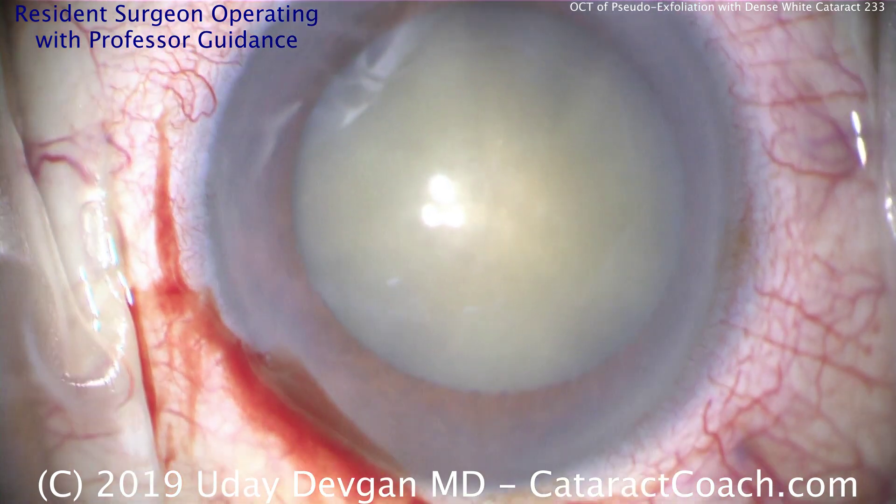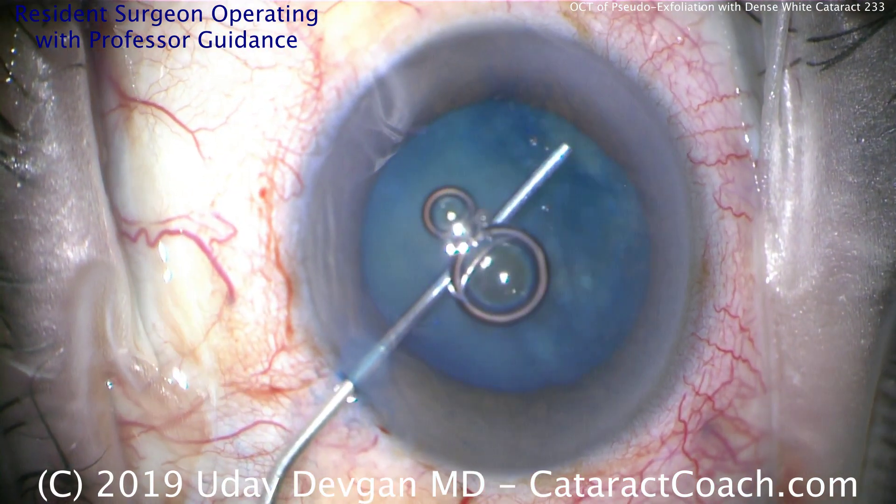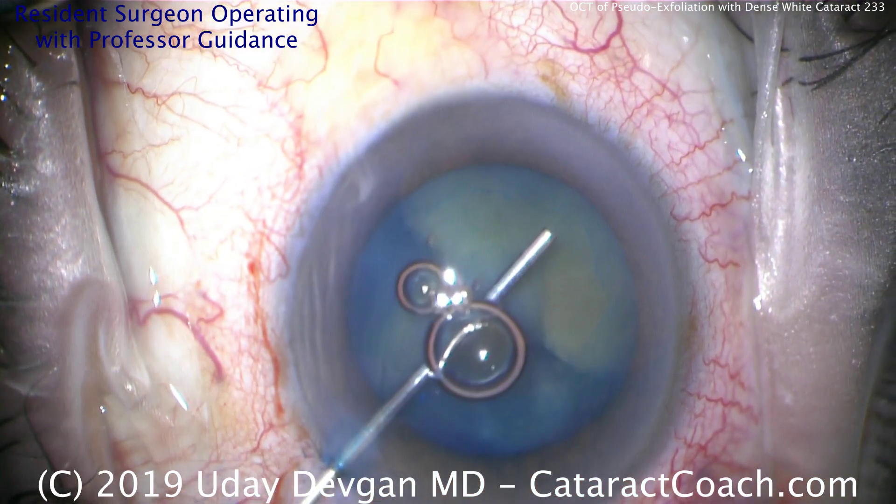Today the case is going to be a resident surgeon who's operating, and he'll have the guidance of me, the professor, teaching him along the way.